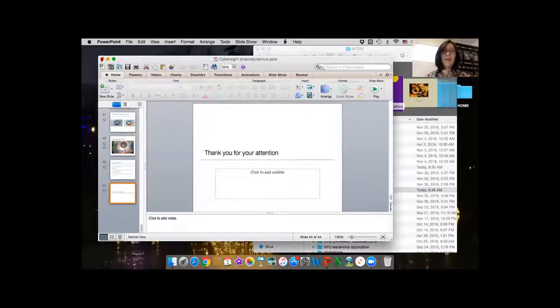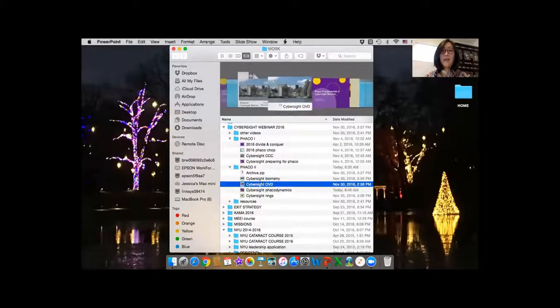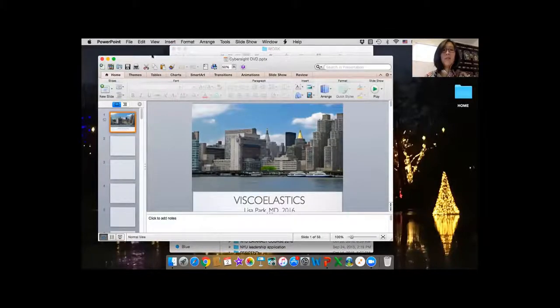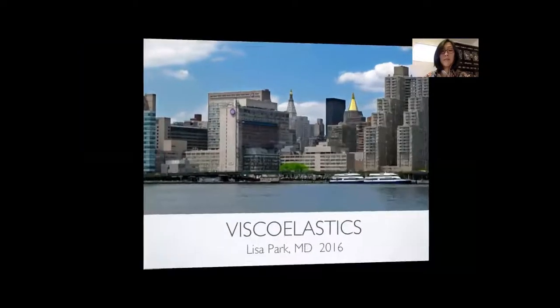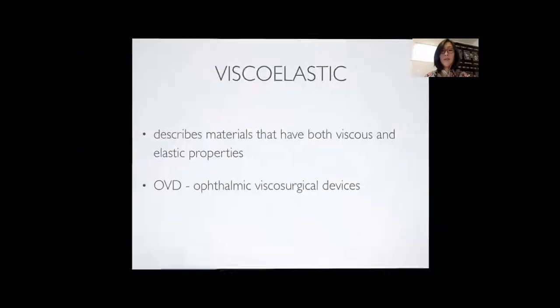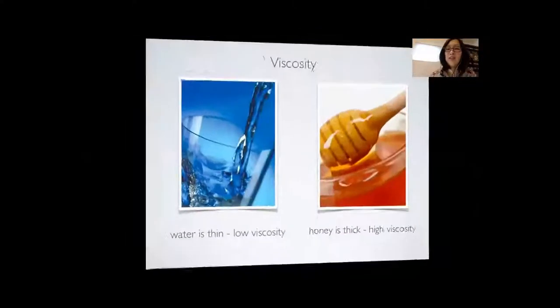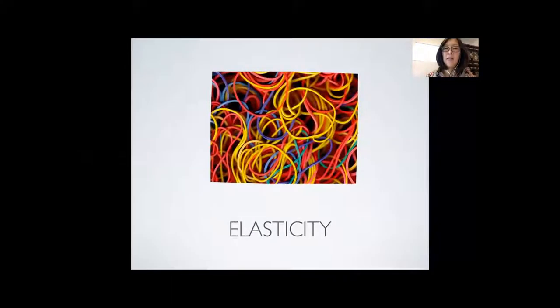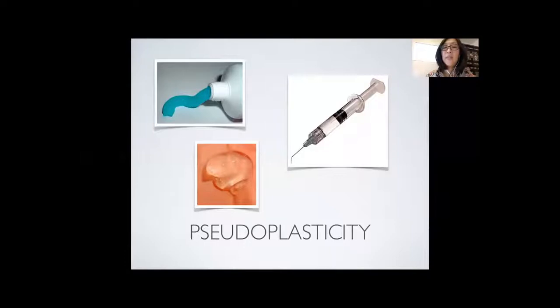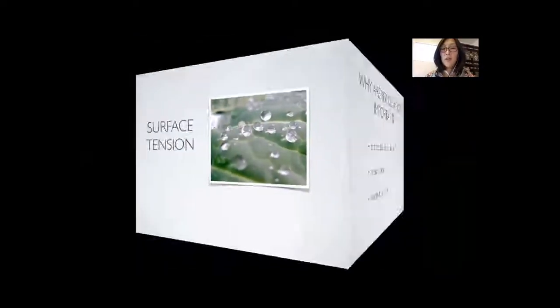So that's phaco-dynamics. We're going to move now to 2 quick things, and that is use of viscoelastics. Okay. So what are viscoelastics? These have various viscous and elastic properties. They can be thick or thin. They're elastic. They change shape under different shear forces, and they coat various tissues.